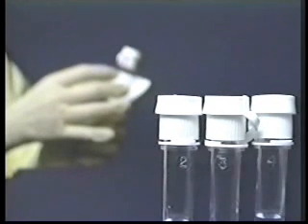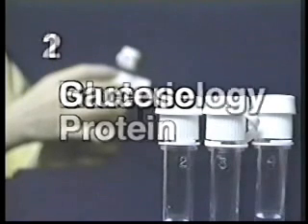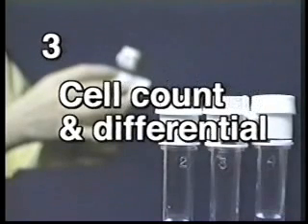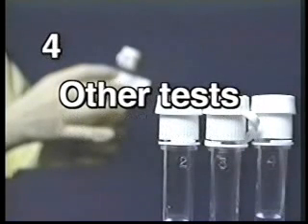Vial 1 is best sent off for chemistries. On your order sheet, write Vial 1, glucose and protein. Don't forget to obtain a concomitant serum glucose. Vial 2 is sent for bacteriology, specifically for gram stain and culture. If you suspect meningitis, request a bacterial antigen panel. Use Vial 3 for cell count and differential. Vial 4 can be held for a variety of other tests, depending on the clinical setting. Make sure you label these vials yourself and ensure that they are sent promptly to the lab.